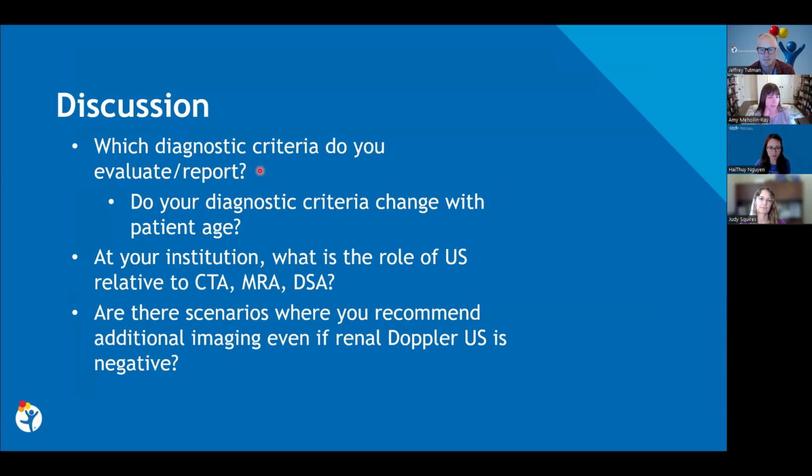Well, I would say I don't use any main renal artery pure number, that 180 centimeters per second that you mentioned. I think it's really important to have the aortic velocity at the level of the renal artery ostia so that you know where the point of flow acceleration is. I don't know what to do with that 180. If you have proximal, mid, and distal renal artery and it goes from 179 to 180 to 181, are you going to call that a stenosis? No. You need to know what it is in the aorta, because is that 180 three times the aorta or is it the same as the aorta?